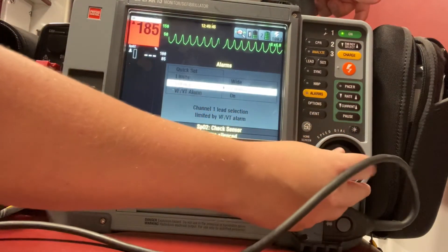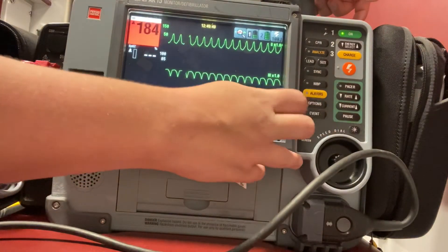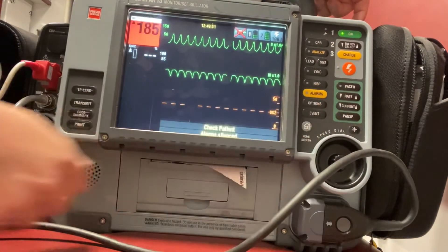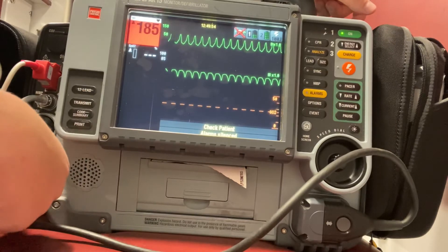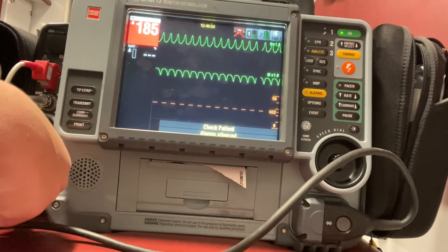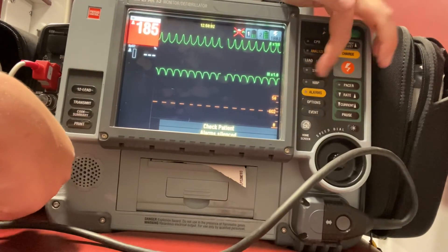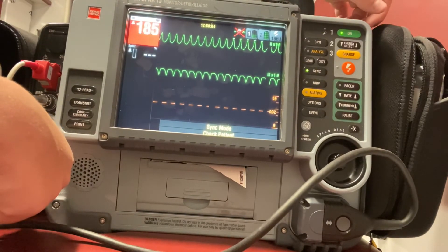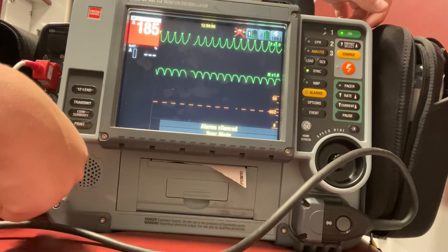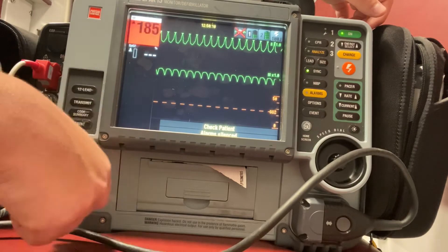I want to go through the process of repeating this shock. An important step: you have to re-sync in order to do synchronized cardioversion again. You need to re-sync before you deliver that second shock, because that sync does not stay on.